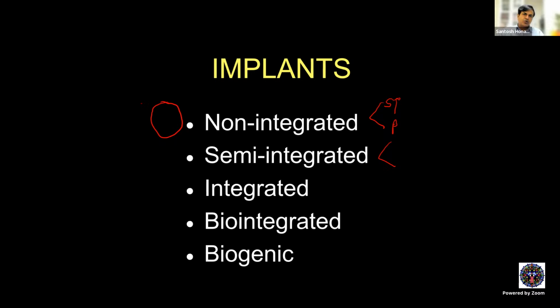And around the pseudocapsule, there will be some fibrous tissue, which will ultimately make it partly integrated with the orbital soft tissue in an indirect fashion. So in the true sense, no implant is non-integrated. Non-integrated is also pseudo-integrated.